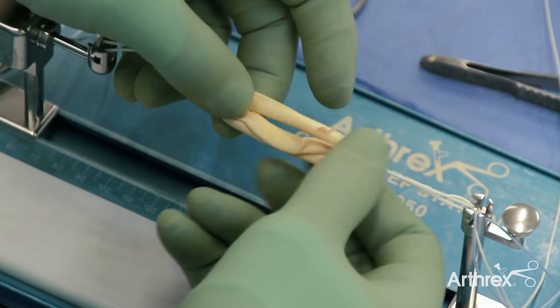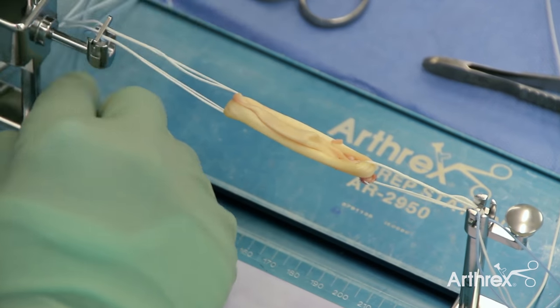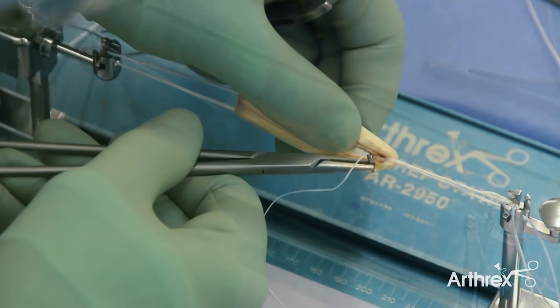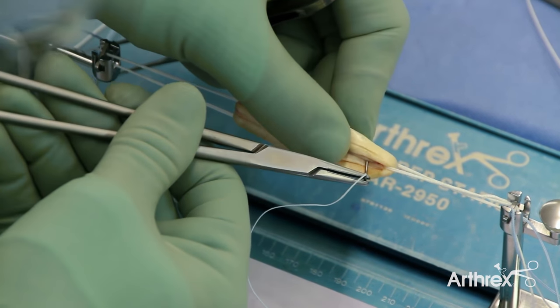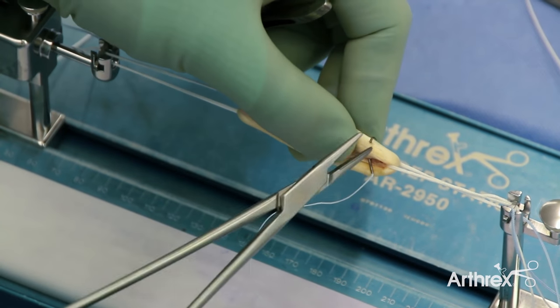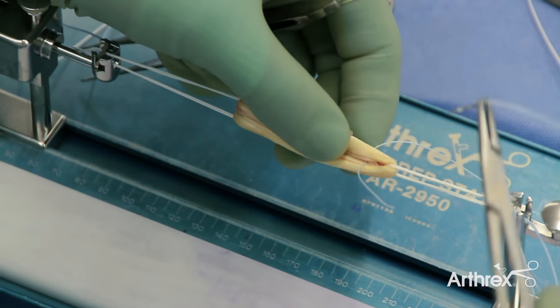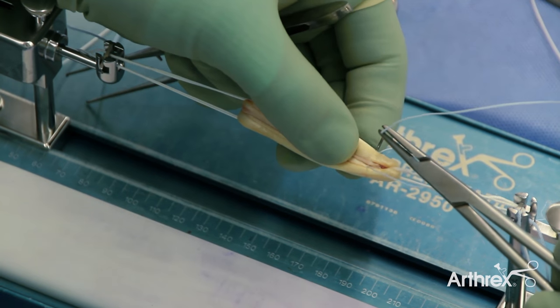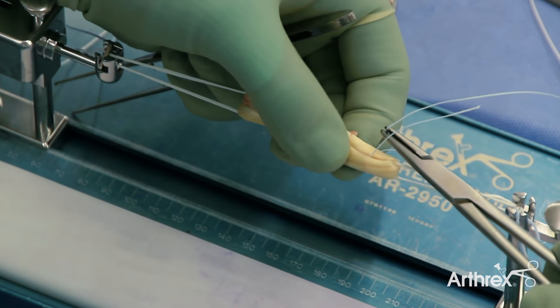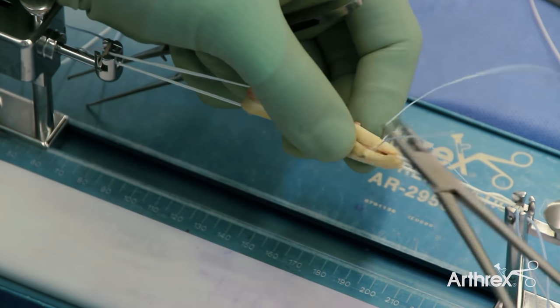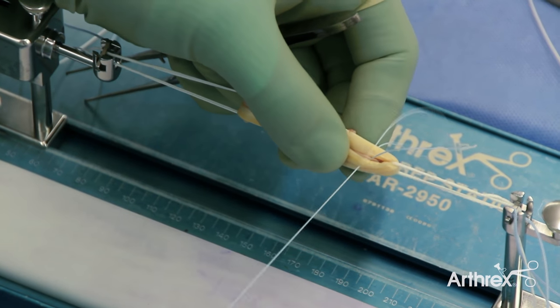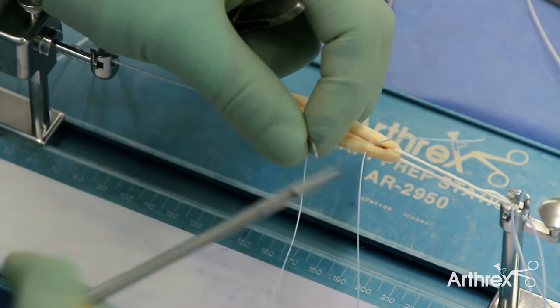Care is taken not to put too much tension through the graft at this stage. The graft is then sutured in the standard way with zero fiber wire, starting on the inside and working out with the needle. The needle can be seen to be passing through all four limbs of the graft link, and this is repeated.